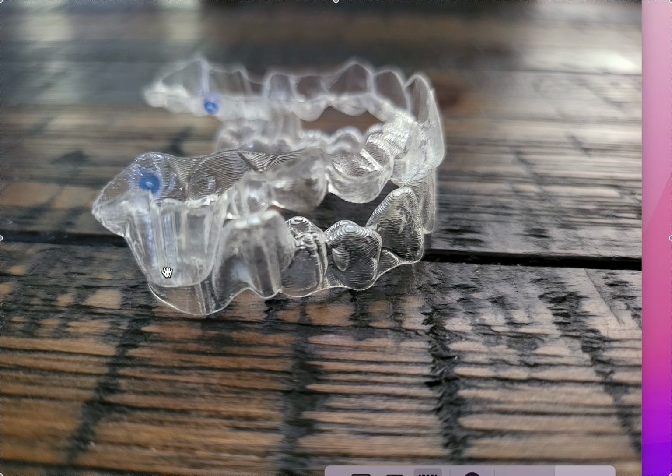And if they don't wear it 24 hours a day, it's not gonna work, okay? So it's not a nighttime only solution. There is no nighttime only solution, in my opinion, that really, really works. Now there's a few products out there, but they don't work like this. They don't work as well, and they're not as effective, and they're not as predictable. So the reason why I like this appliance is that it's very comfortable. From the front, it only looks like an Invisalign, so you get a lot of compliance. I have zero problems getting patients to wear these type of things. I've never had a problem, though obviously you got to pick a good patient and parent. It can't be weird stuff going on at home. You got to have good communication. It's all about picking the right family who seems to understand.